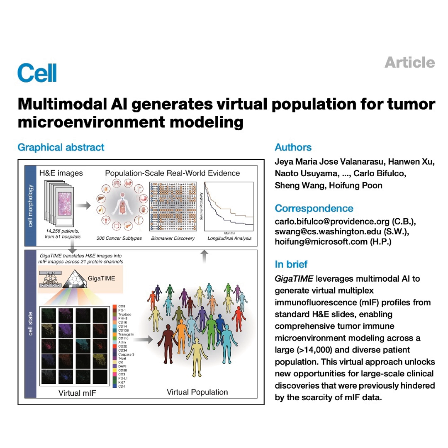So here's the final thought for you to take away. We saw that the AI was best at translating nuclear proteins because their shape, their morphology was so clear in the original image. If AI can pull this much information about a cell state just from its shape and its neighborhood, what other expensive biological signals we currently measure with complex chemistry are hiding in plain sight, just waiting to be unlocked in our vast archives of routine, low-cost images?